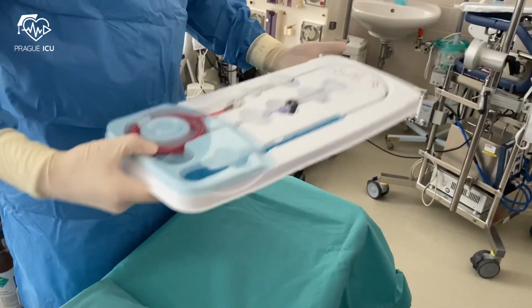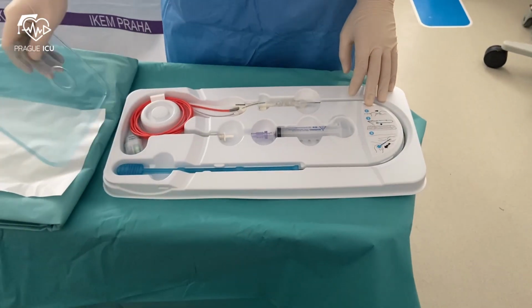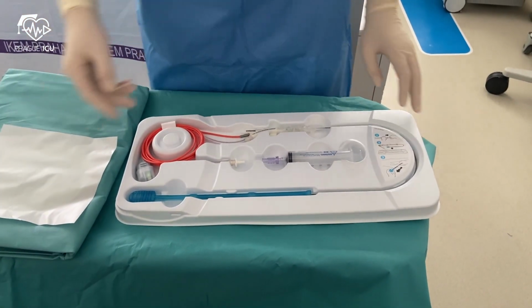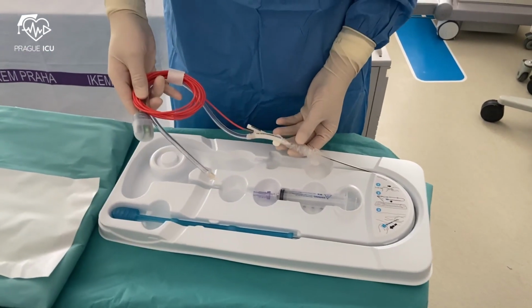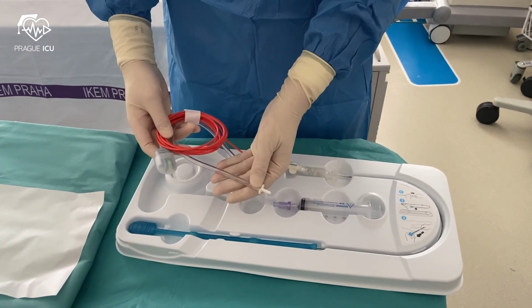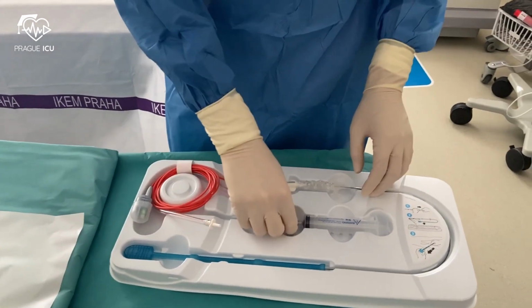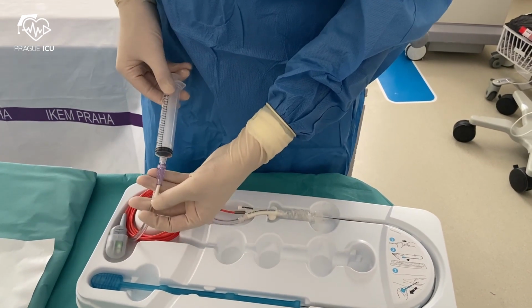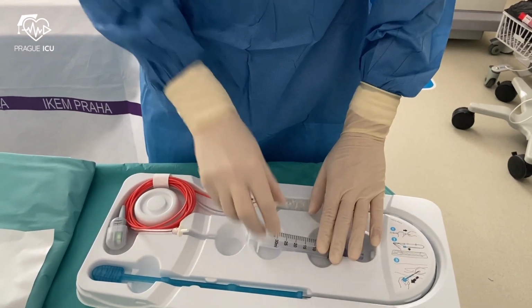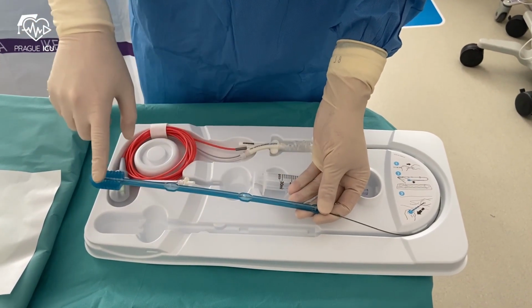The balloon catheter tray contains the balloon pump components. Here is the catheter extension tubing, cable to fiber optic signal processor, and syringe with a one-way valve that we use to fully collapse the balloon before insertion. Finally, here we can see the intra-aortic balloon itself.